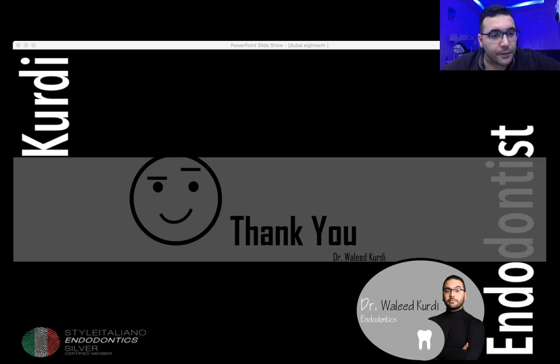What other question? How about 6x magnification, doc? Is it good enough? What about someone will tell me 7x magnification, 8x magnification? I need to tell you, in some operating microscopes, 6x magnification is the first step in microscope. I know that a lot of people don't have a microscope, but in retrieval it's a little bit a must, guys. 6x may help you indeed, but you will not be conservative as the one with the microscope.